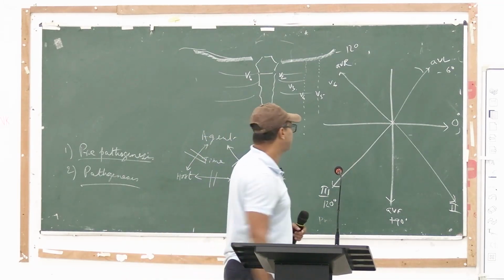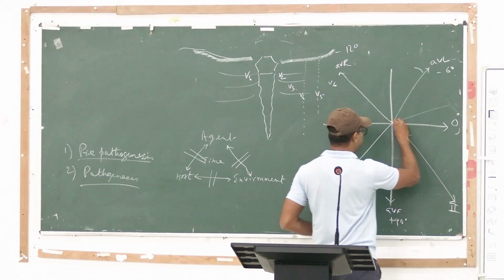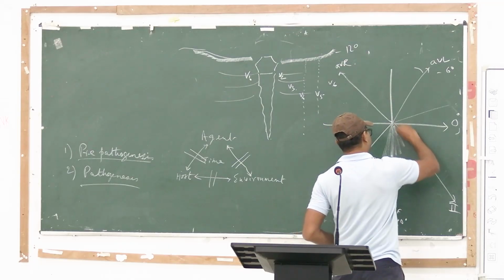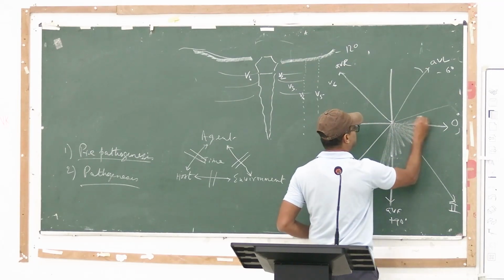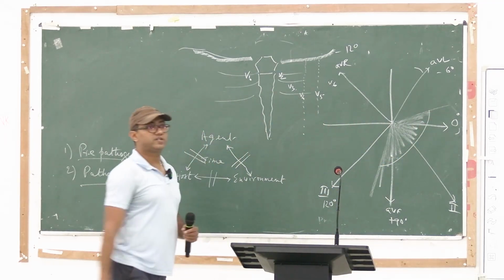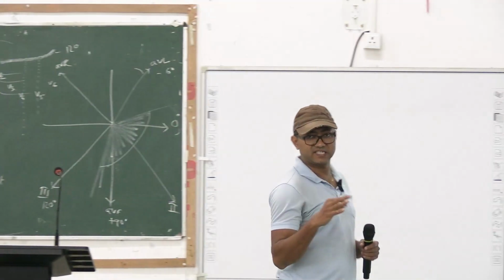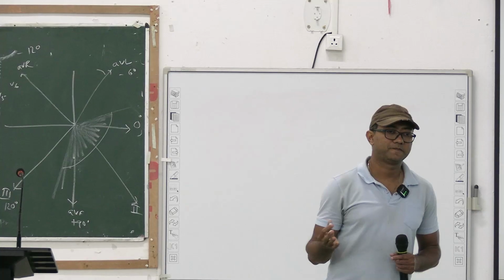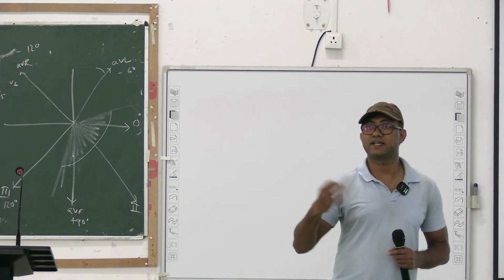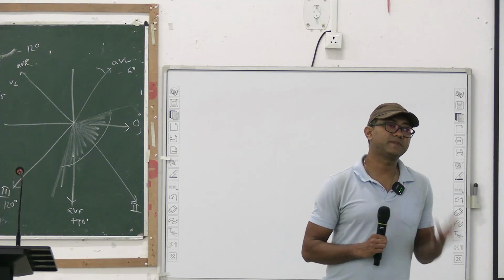Clear? Now your mean electrical axis is located within this region. This is the location of mean electrical axis. You remember or forgot about ECG axis? What is ECG axis or mean electrical vector? ECG axis is same as that of mean electrical vector. You remember what is mean electrical axis?